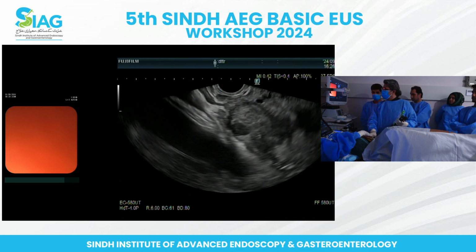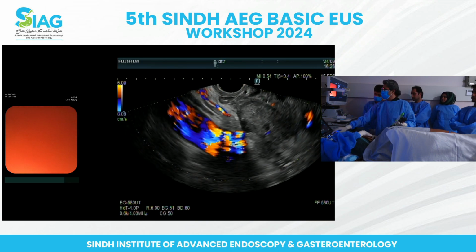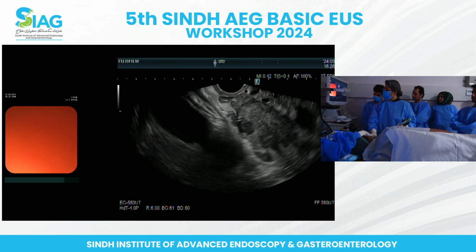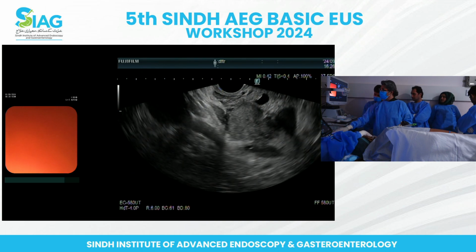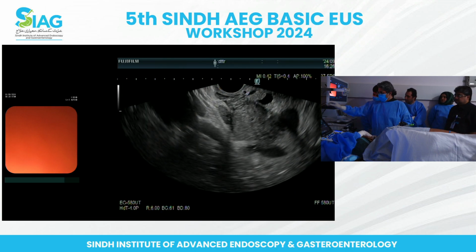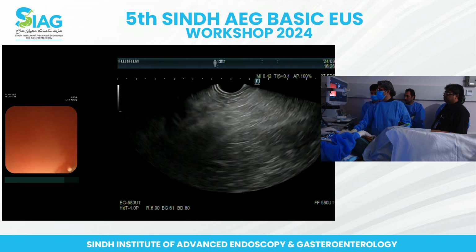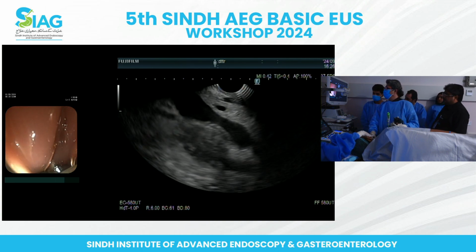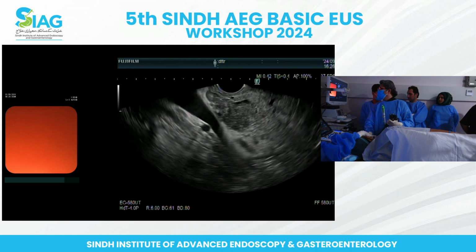And here, I think, this is the D1. But it's relatively unstable. Maybe if you want to go here, that should work. True. So if everyone can see this, where is the ABC? Right there. Yep.